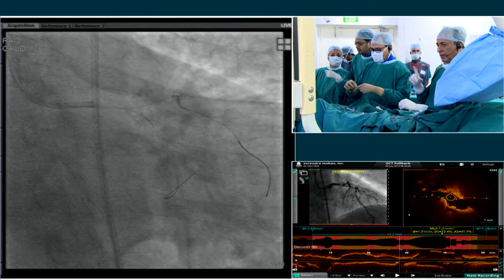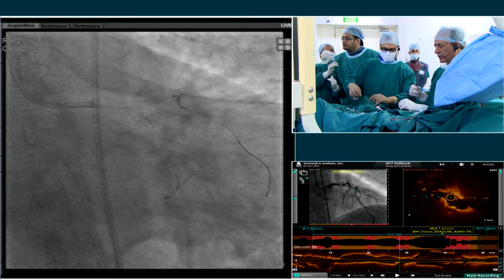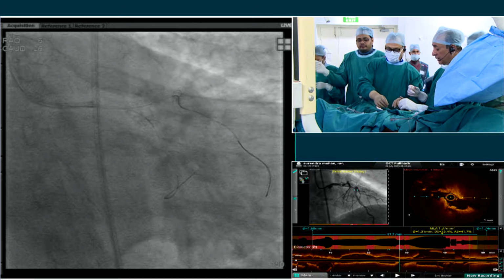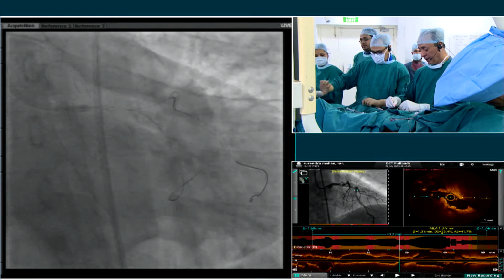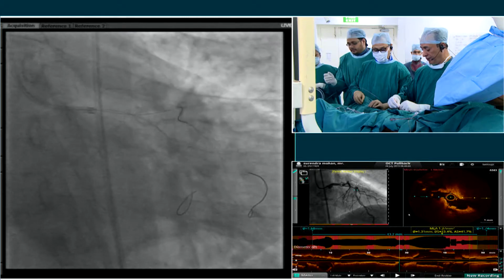This time, we'll take a run from circumflex. As Ajay pointed out, that circumflex stent, we want to see if it is, this is what size? Oh, the first balloon is left main. I'm putting that 3.5 and 12.